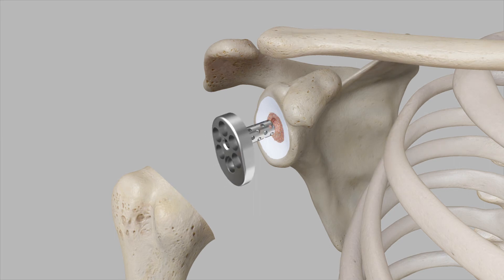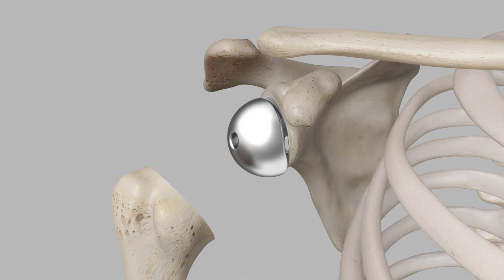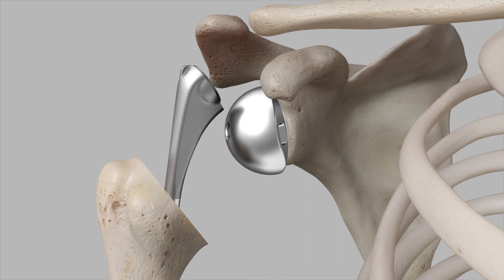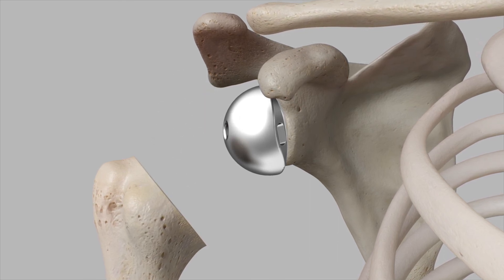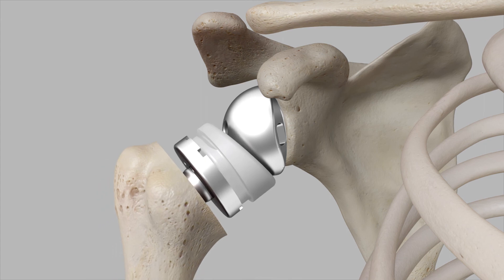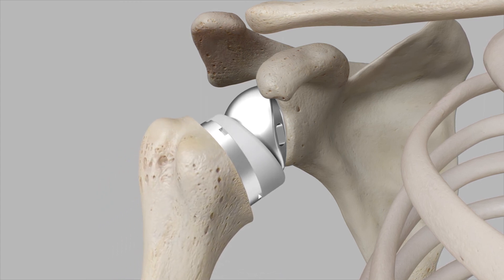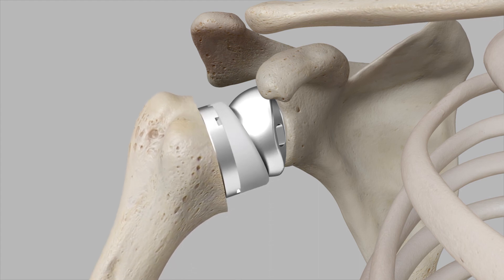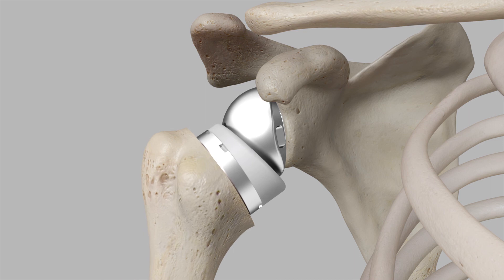A glenoid plate is inserted to act as a base for the metal ball, the glenosphere. A metal stem is then cemented or press-fit into the canal of the arm bone, depending on the surgeon's preference. The metal ball is fixed to the socket, and a plastic component, the humeral liner, is fixed to the upper end of the humerus, essentially reversing the ball and socket joint's original position.